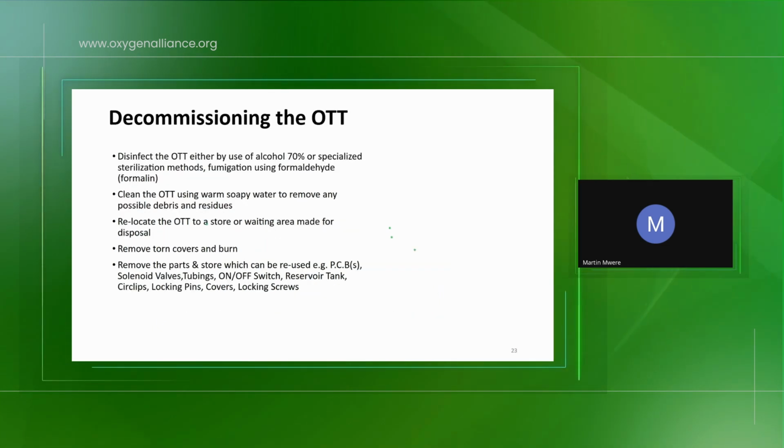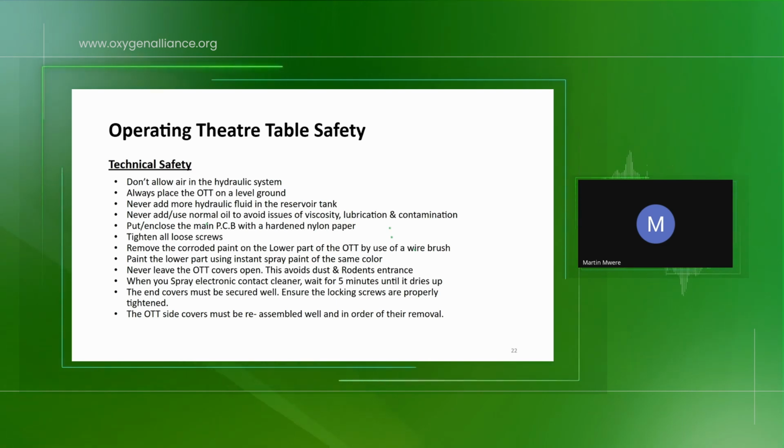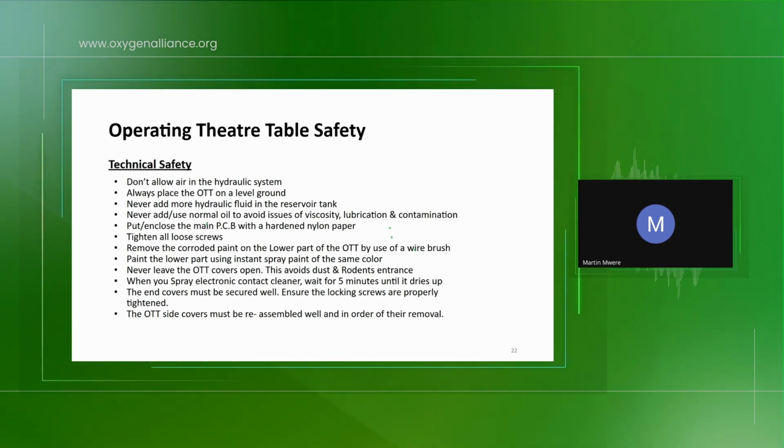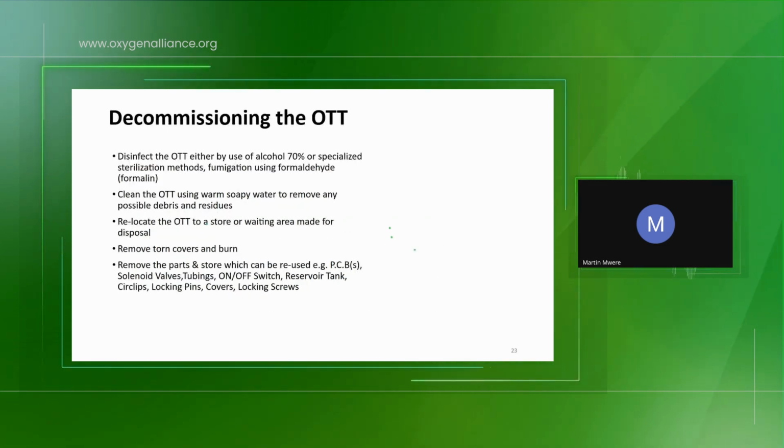The end covers must be secured well. Ensure the locking screws are properly tightened. The OTT covers must be reassembled well and in order of their removal. This is very important, in order of their removal.